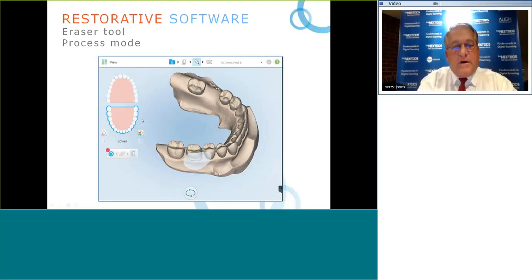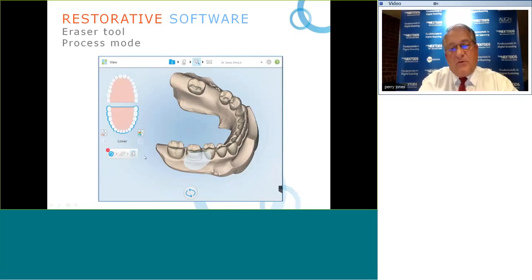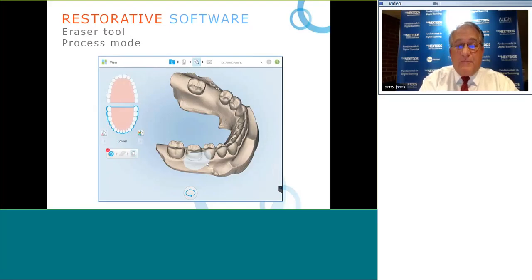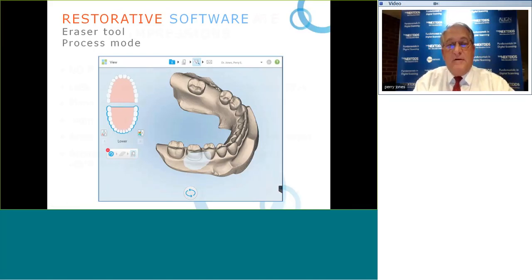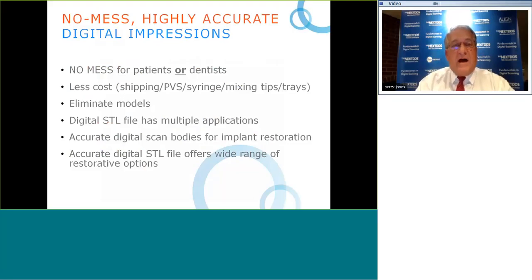There is also an eraser tool. In process mode, you can choose the upper arch or the arch with the target tooth. If there is contaminating data — saliva, blood, or anything from the initial scan — you can use the eraser tool to erase that area and retake a segment of data, which is automatically stitched back into the full view. These tools are available because of the high accuracy of digital impression taking.